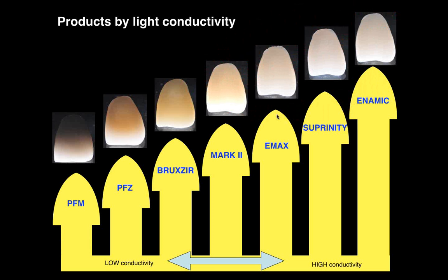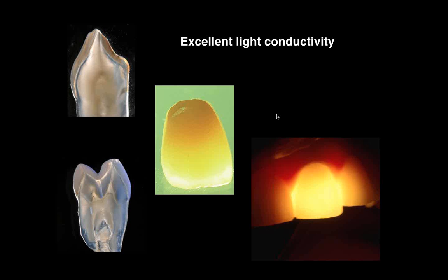Where it starts to get a problem are the full zirconium oxide. It's not so bad. Porcelain fused with zirconium oxide or metal, they don't let the light really through. You can really see that these crowns are in the mouth. It depends where they're placed when the light is shining in the patient's mouth. Good. Then, let me go to the next one.